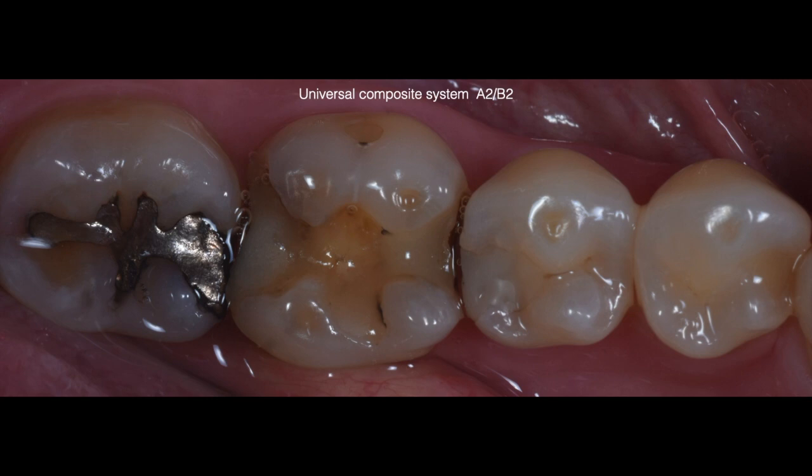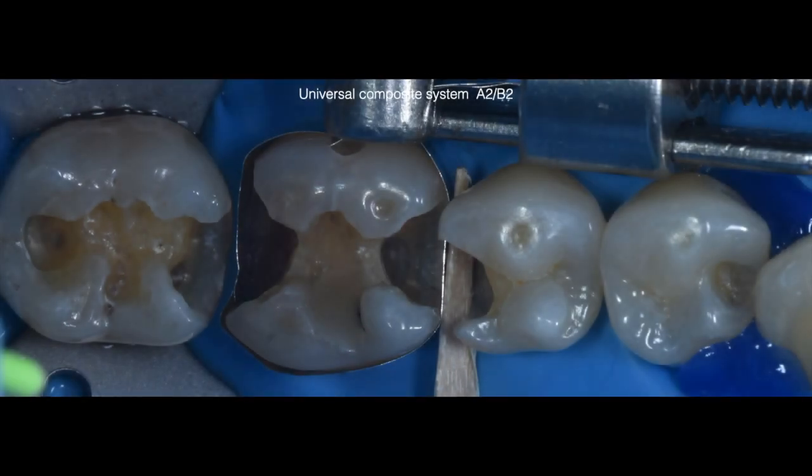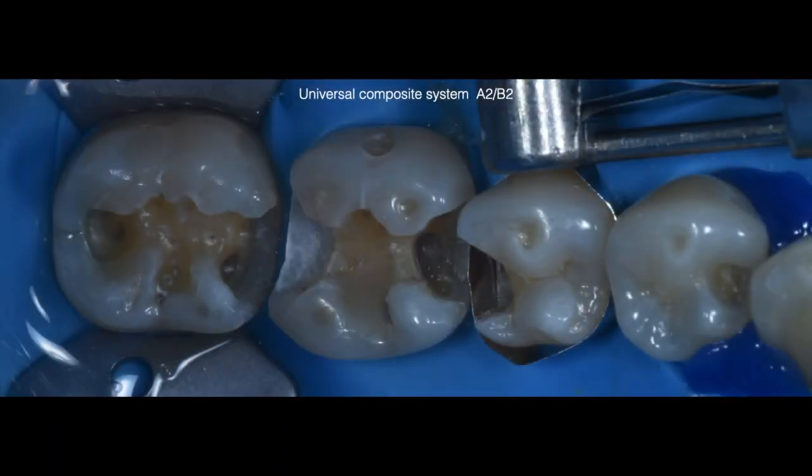Now let's look at what I consider my single shade for all posterior teeth I restore, Brilliant EverGlow A2B2. For this patient, I am going to do multiple restorations in a single appointment. All preparations have been completed. We started out with deep margin elevation on tooth number 19, followed by deep margin elevation for tooth number 20. In both cases, we use resin modified glass ionomer to achieve that margin elevation.